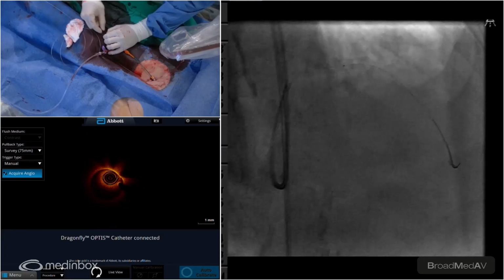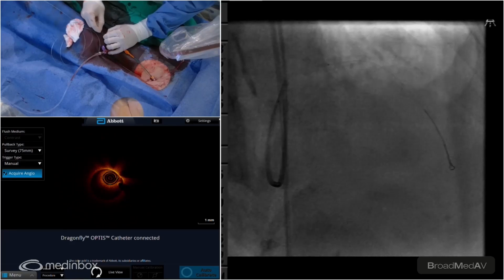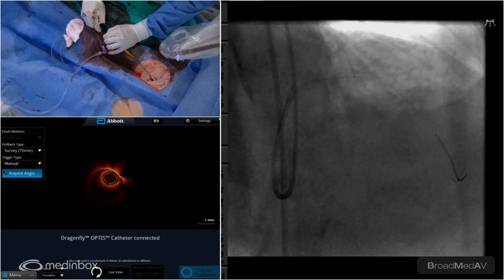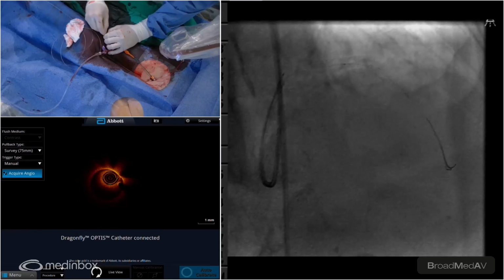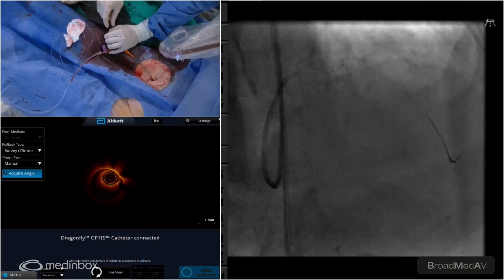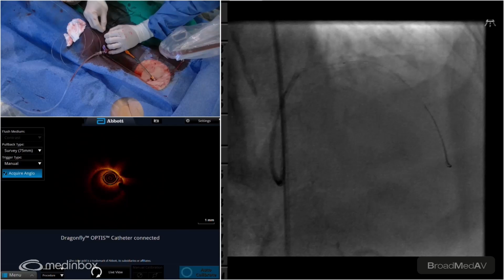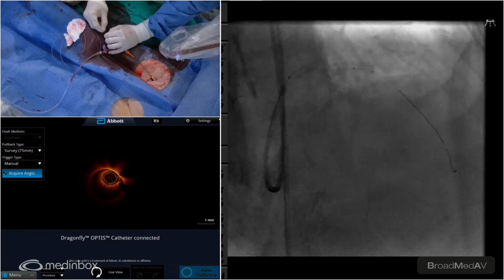Well, there we go. What a bit of traction. If Arjun gives you some pull on the BMW as you're pushing. Yeah, just pull the BMW a little bit and see whether I can straighten it out. No, it's just buckling the RX port. I'll pull back the BMW more. You have lots of room. Pull. Yeah, it's not working.